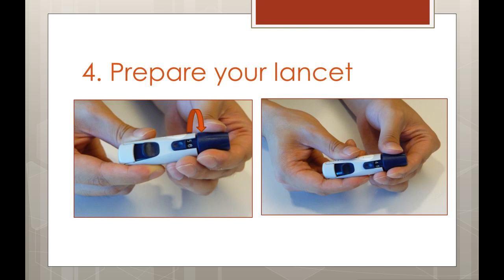Now that our lancet device is ready, it's time to adjust the depth setting that will control how deep the lancet will puncture. This lancet device goes from 1 to 9, with the smaller number having a shallower puncture depth. Your lancet device may differ slightly, but most are very similar. Start at a low to medium setting at first. If you discover that you need a higher setting to get an adequate drop of blood, adjust your lancet device accordingly.